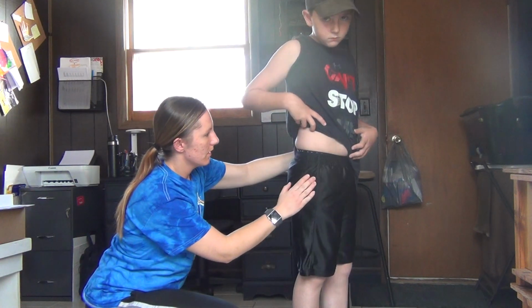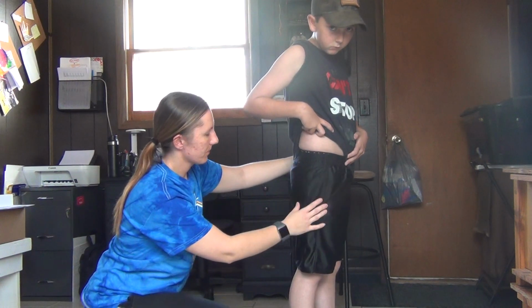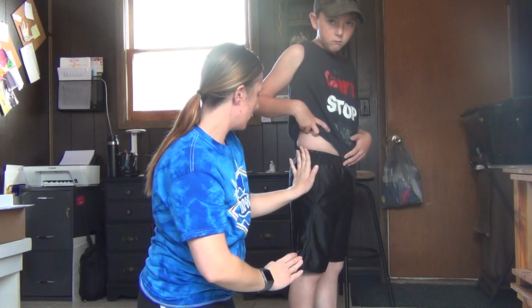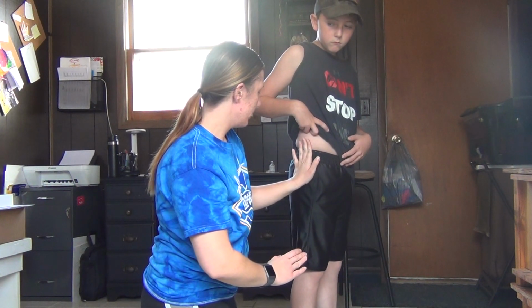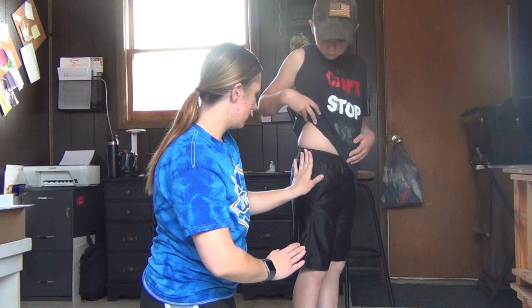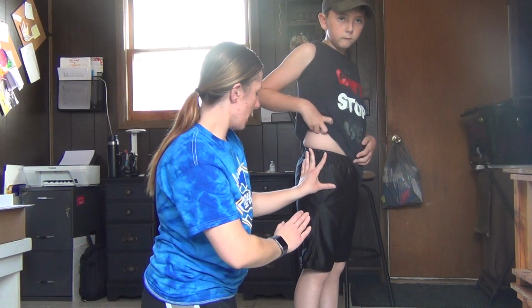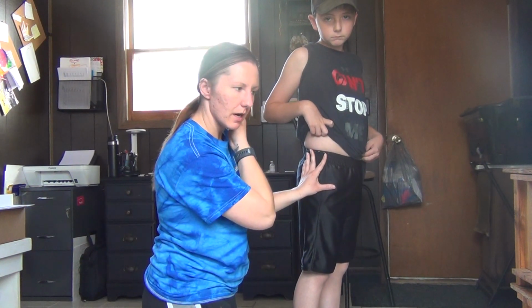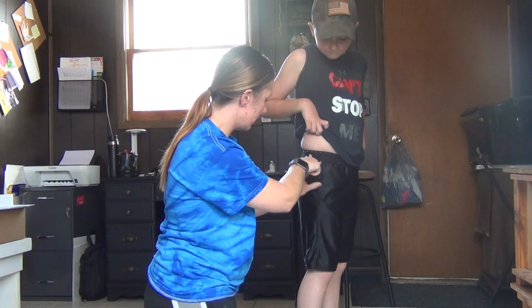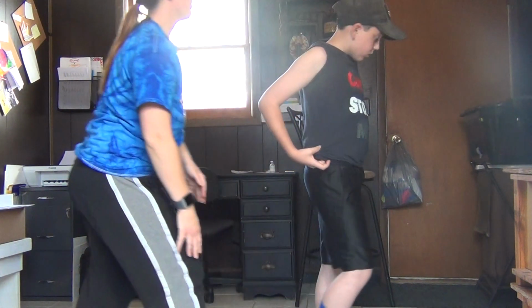And then for the ventral gluteal, I would again find the greater trochanter, and typically I would have my palm on it, but because he is smaller, I'm gonna drop it down like that. And then I would have the iliac crest and iliac spine, so then I would do the injection here. All right, if you want to sit back down.